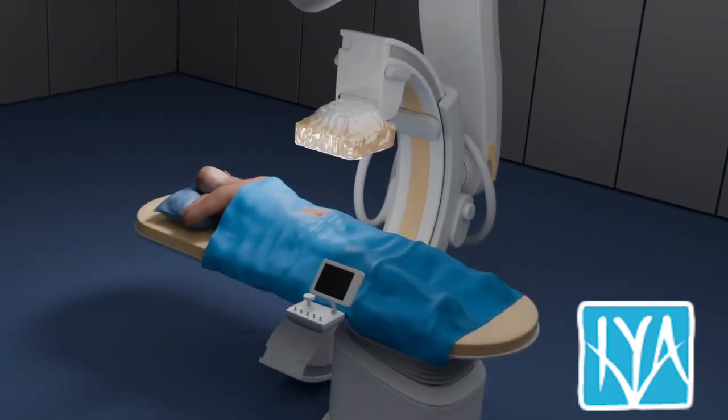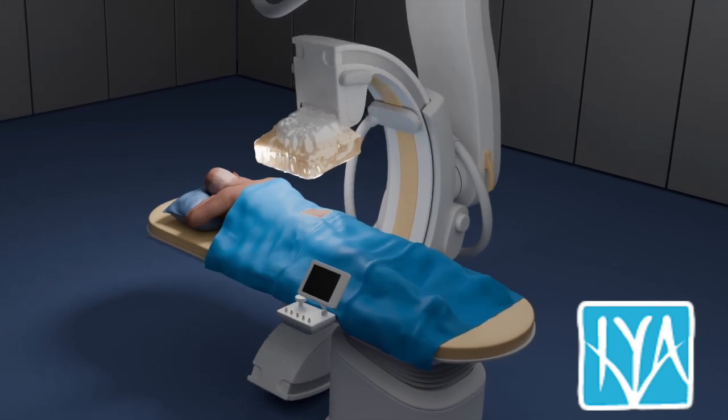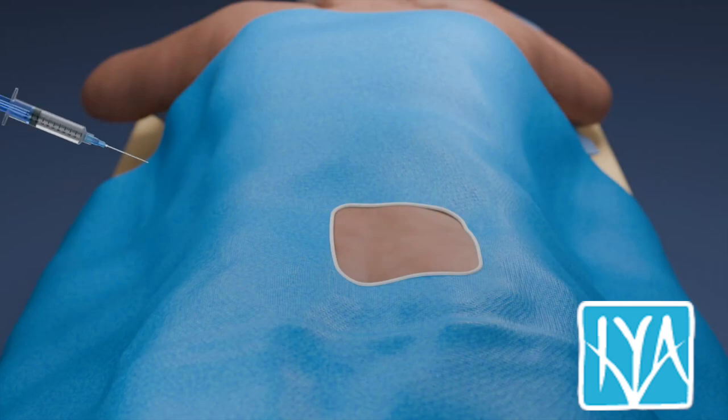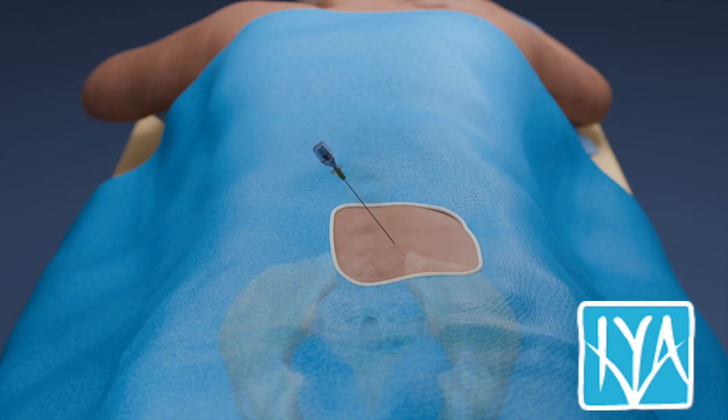If using fluoroscopy for guidance, the proper trajectory for needle advancement is picked. Then, local anesthesia, such as lidocaine, is injected to numb the skin, followed by numbing the subcutaneous tissues and periosteum using a Chiba needle, ensuring patient comfort during the procedure.